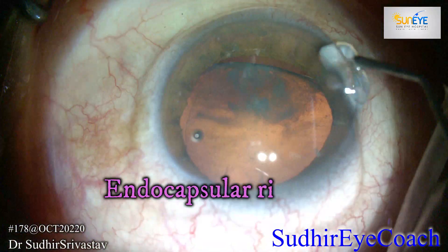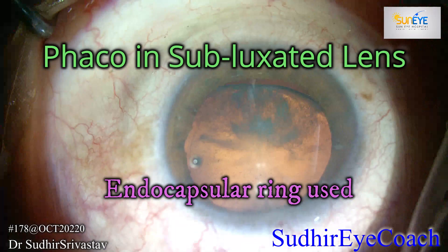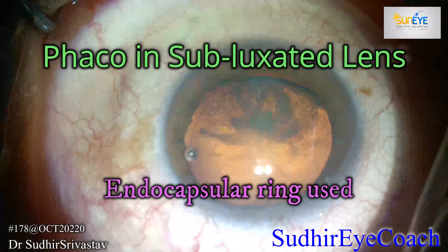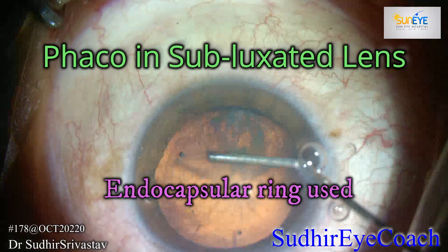Hello everyone, welcome to Sudhaid I Coach, a channel for budding ophthalmologists. Today I'll be sharing a video where I perform phacoemulsification in a subluxative lens patient who presented with a history of trauma and cataract.